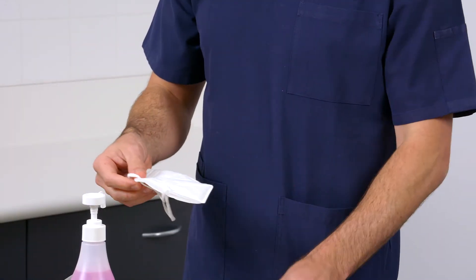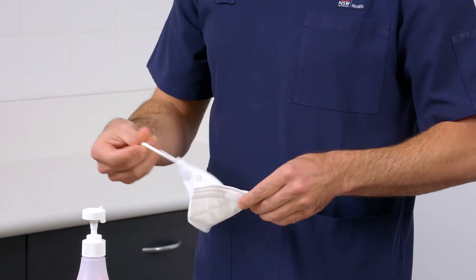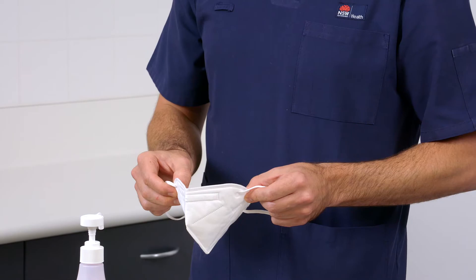To don the respirator, remove the respirator from its packaging and inspect all respirator components for damage prior to each use. Pull out the loops and make sure the nose piece is fully unfolded away from you.